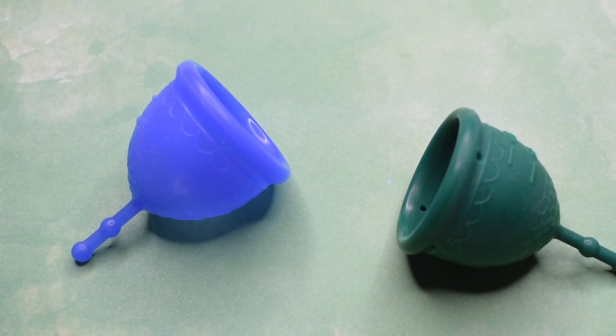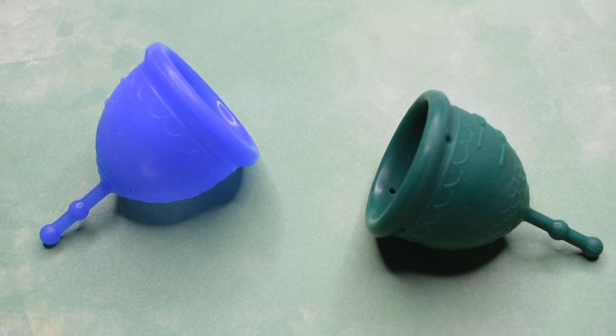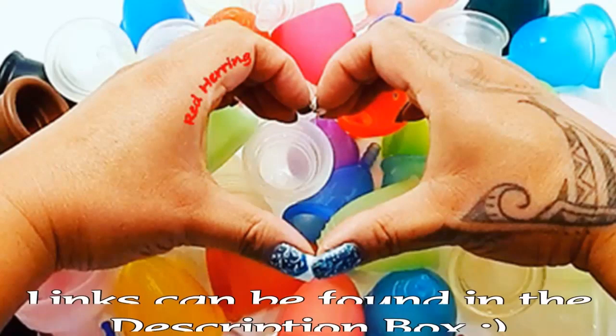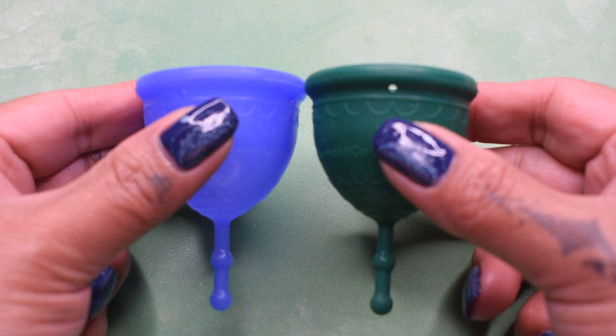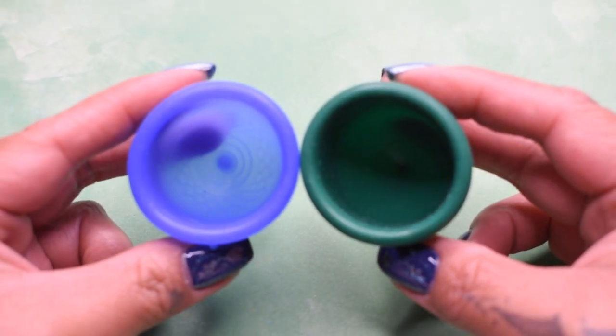This is a squish comparison between the Mermaid Cup Guppies, or low cervix, in both the soft and firm versions in a size small. I'm gonna place both of these cups in the palms of my hands, give them a squish, swap hands, give them a squish again, and then compare the rims.